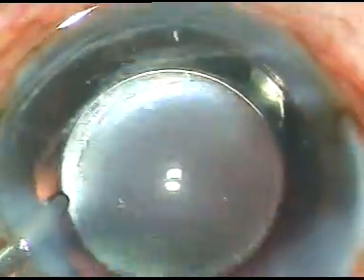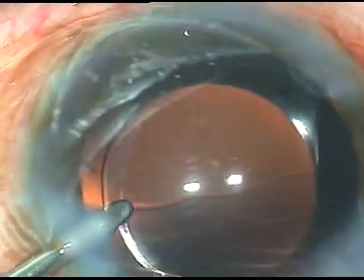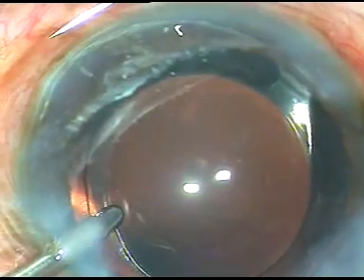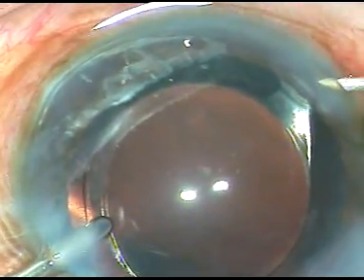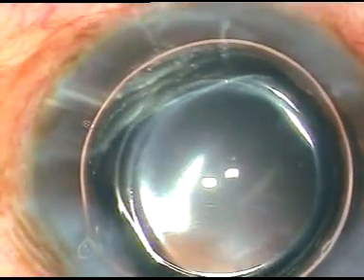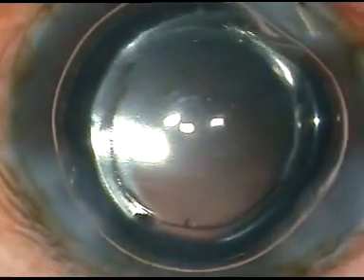That's it. So we are towards the end of the surgery. I'm injecting an air bubble before I come out. And now I hydrate the side ports. Why I injected the air bubble?